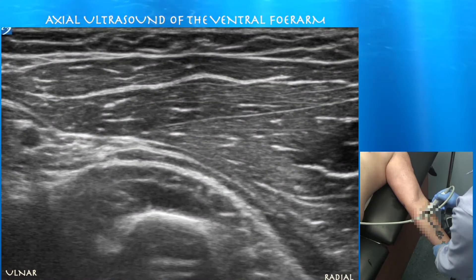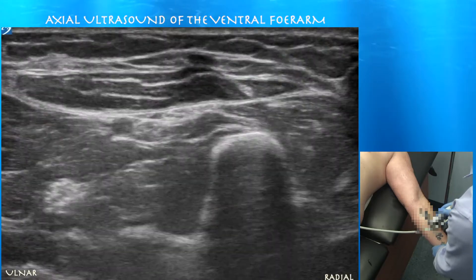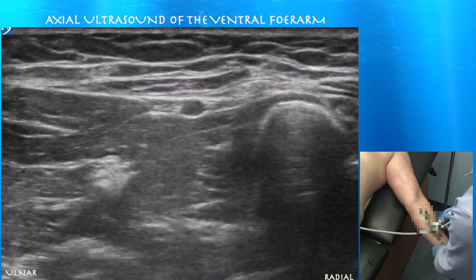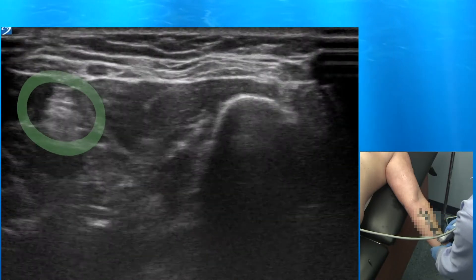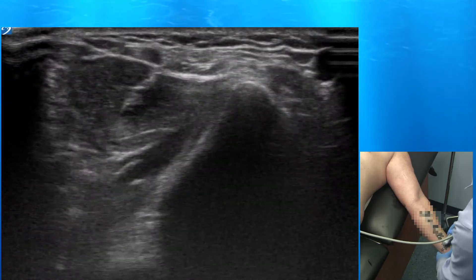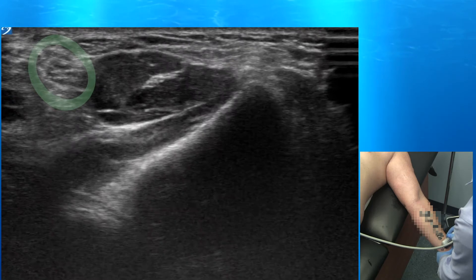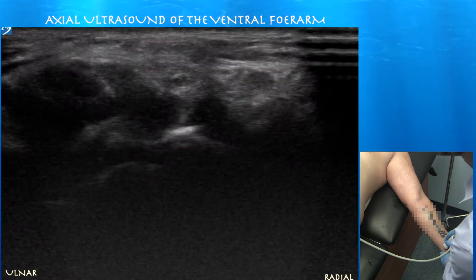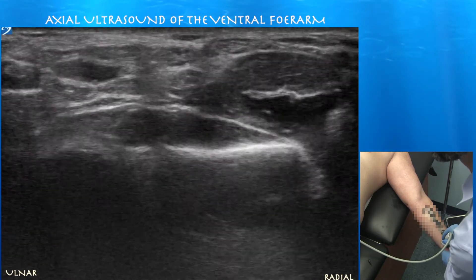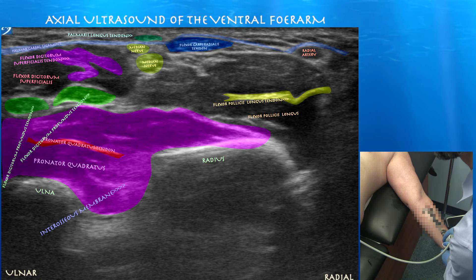Radial head. Now we're just gliding pretty quickly distally. We can follow that median nerve in the middle of the screen — that hyperechoic circle — going superficial right now and in a radial direction. Now we're getting closer to the wrist. You can start seeing the flexor pollicis longus tendon formed within that muscle surrounding it. You have the flexor carpi radialis tendon superficial to the carpal tunnel. You can also see the very thin oval palmaris longus tendon superficial to the median nerve.